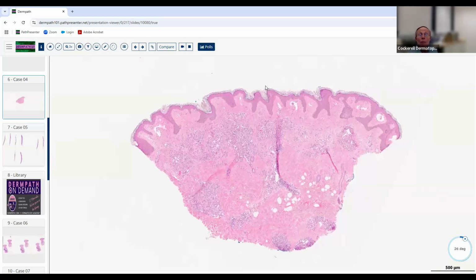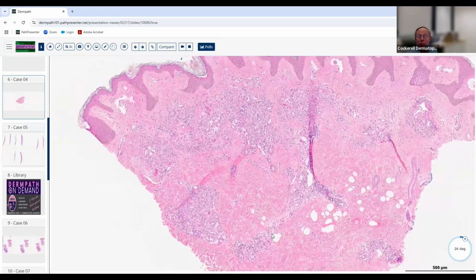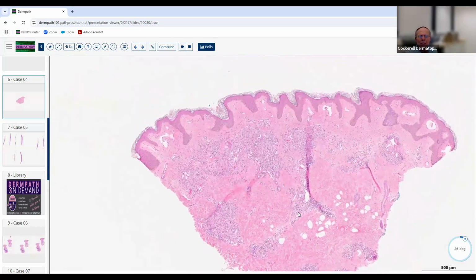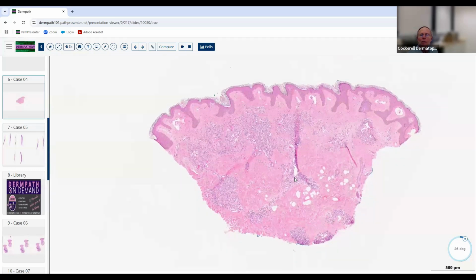We can look and see, well, based on this biopsy, is it symmetrical, well circumscribed? Well, the answer is no. It goes to both edges of the specimen and to the base, so it's certainly not well circumscribed. Is it symmetrical? Well, not really either. This is a piece of something bigger, but it's much more cellular and more dense over here than it is over here. So those are yellow flags to us. We're a little bit concerned when we see something like that.